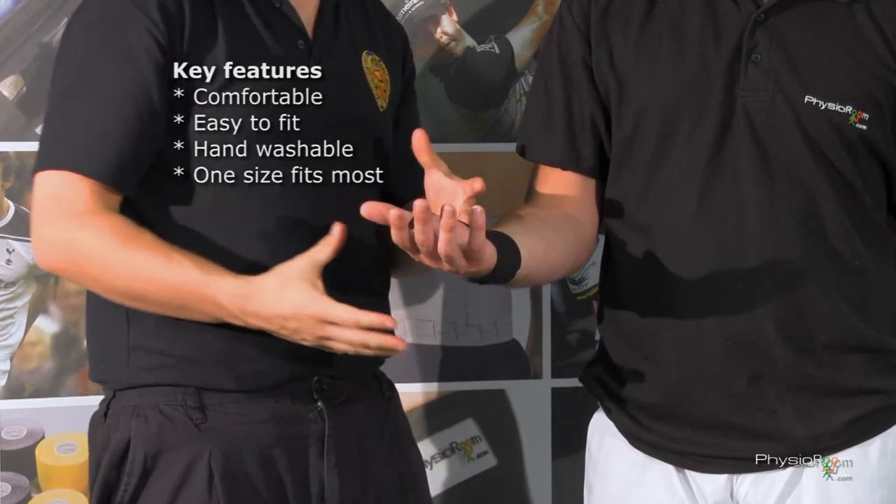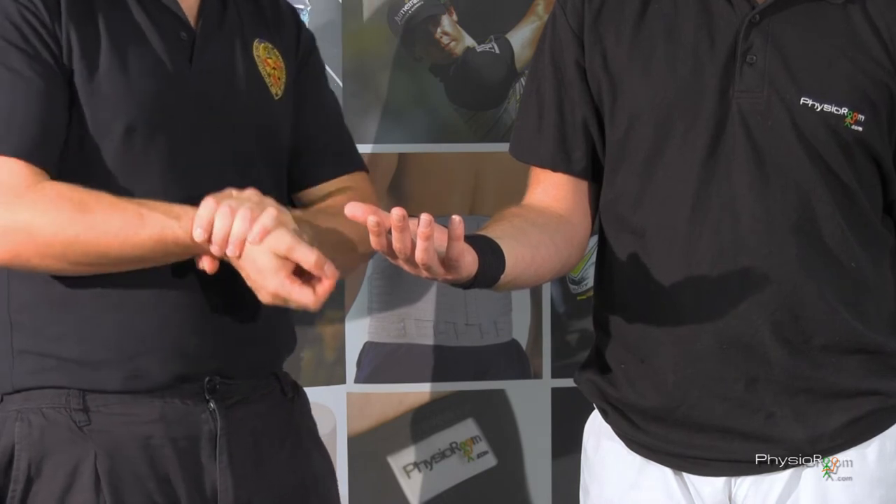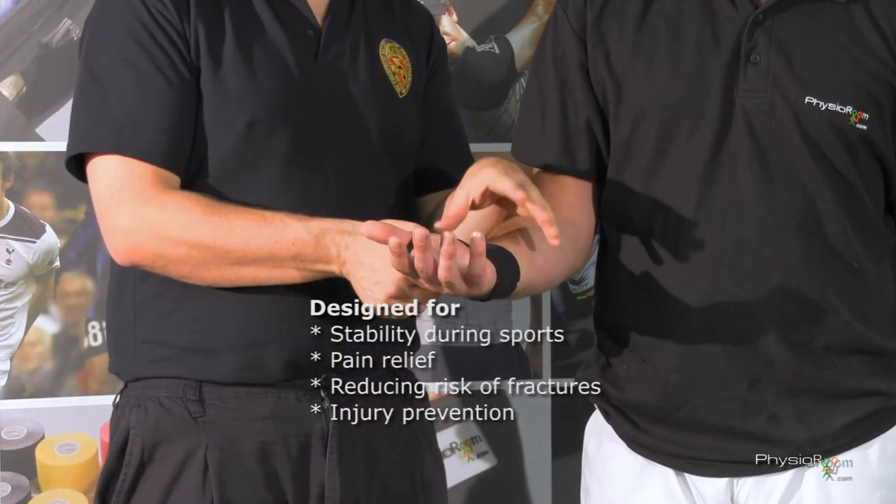There you go — easy application, really simple to use. Things you can obviously use it for medically: just to give some support to the wrist if you've got chronic wrist pain or any wrist arthritis.